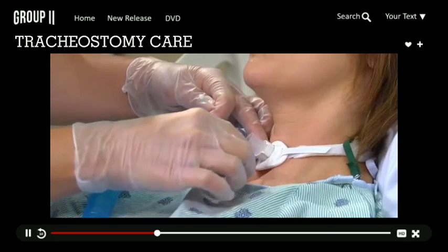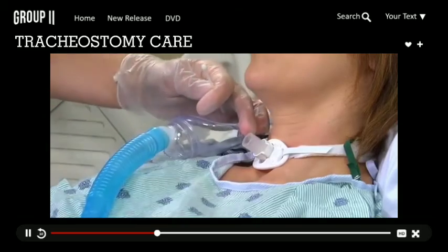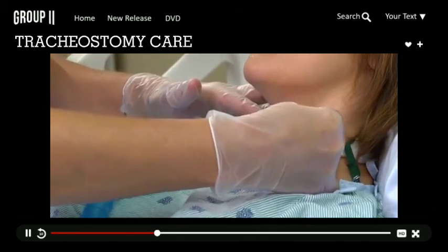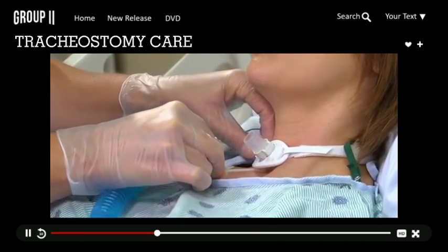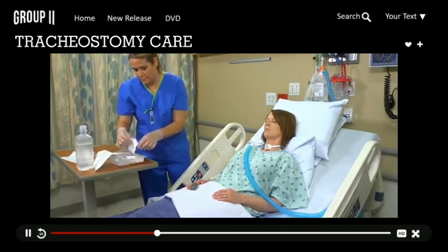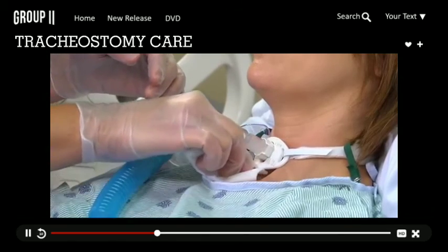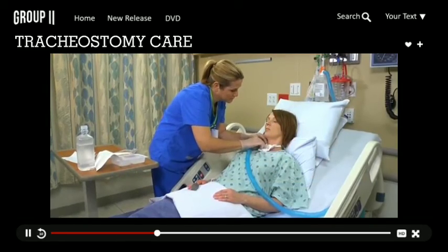Begin at the inner edge and move outward in circles, covering a 2 to 4 inch margin around the stoma. Be sure to include the area under the faceplate. Pat dry the skin and exposed outer surfaces of the cannula. Apply a new drainage sponge.